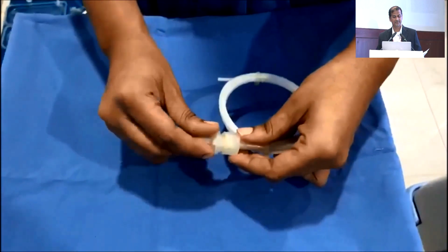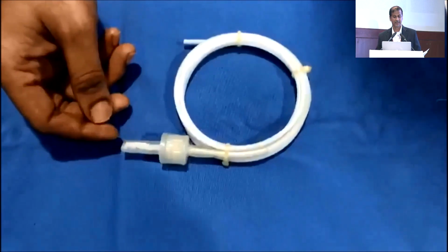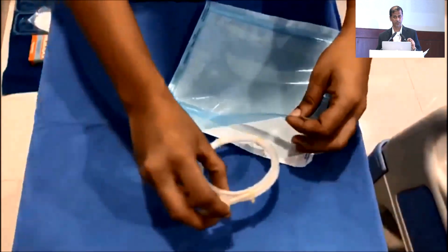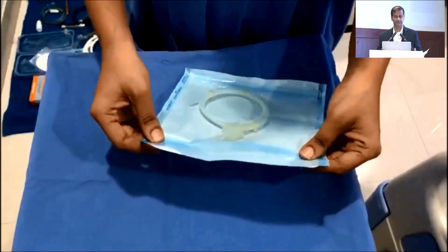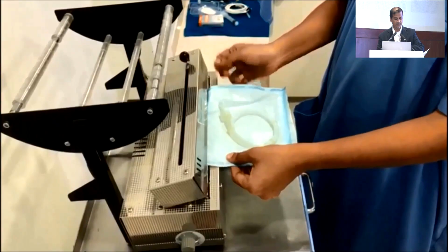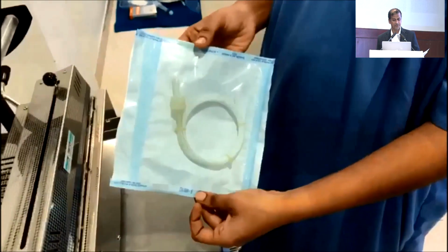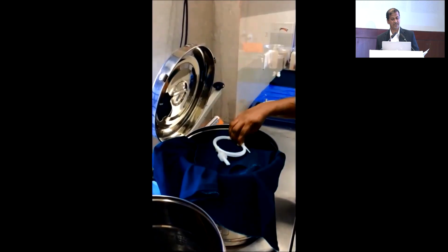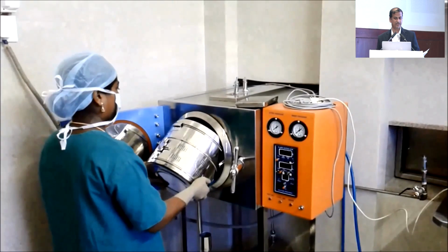Then the strip is placed inside the housing, which is then screwed into the housing here. Then again, this tube has to be packed the way you pack your instruments to simulate the exact way your instrument has been exposed to the steam. These have to be sealed with a medical grade sealant, and then placed the way you place your instruments. Basically, you have to ensure that the helix test also undergoes the same process. It can also be placed inside your linen load if you want to test your linen.